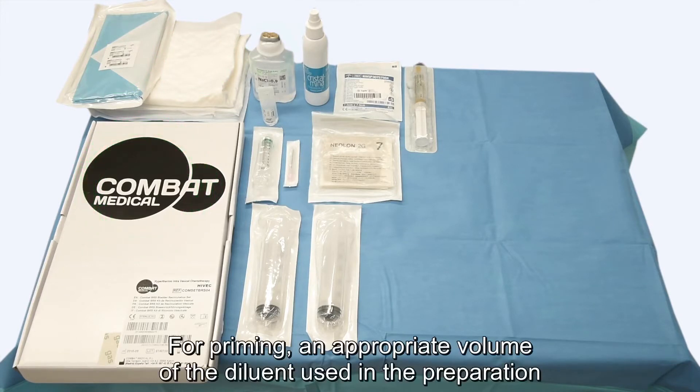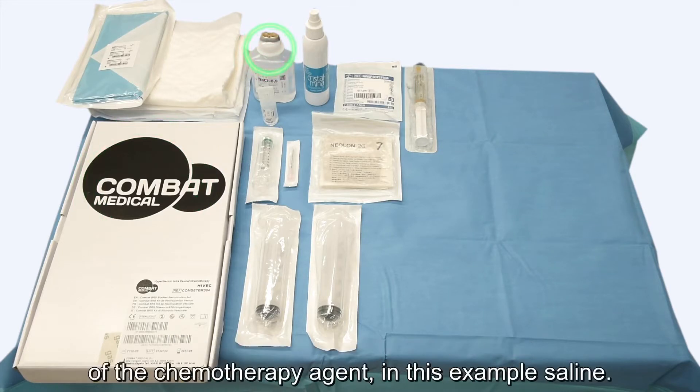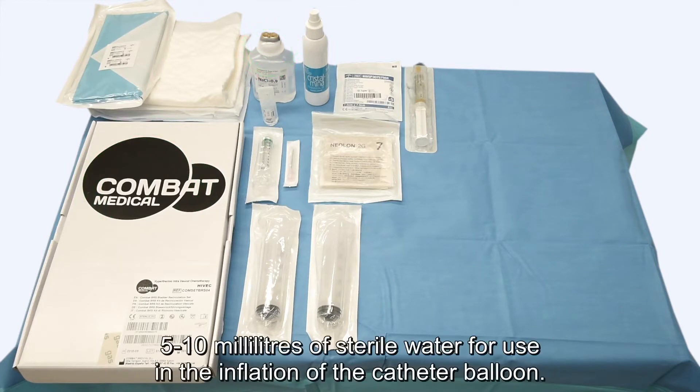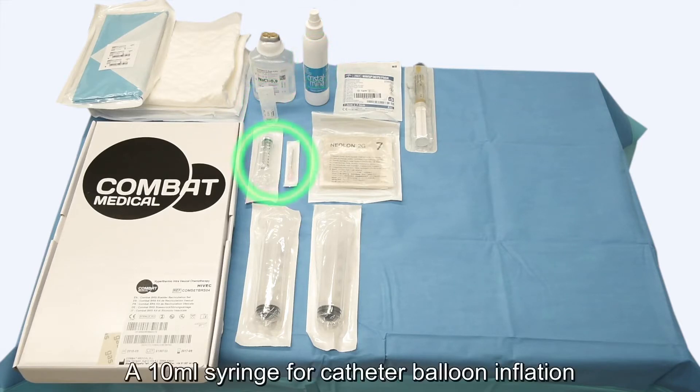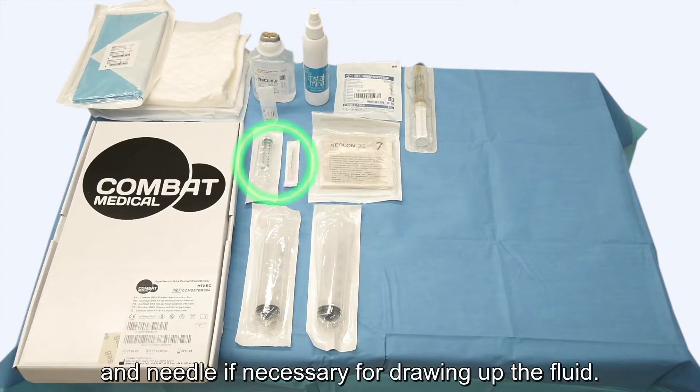For priming, an appropriate volume of the diluent used in the preparation of the chemotherapy agent, in this example saline. 5 to 10 millilitres of sterile water for use in the inflation of the catheter balloon. An appropriate local disinfectant. A 10 ml syringe for catheter balloon inflation and needle if necessary for drawing up the fluid.